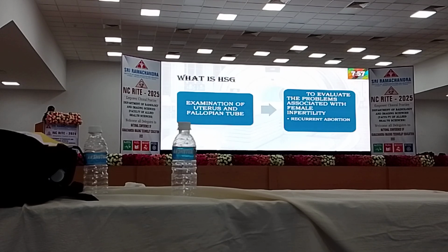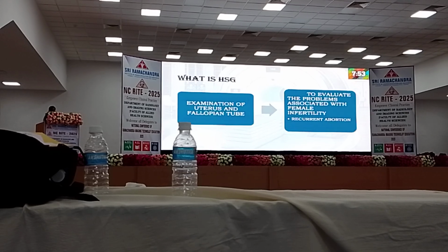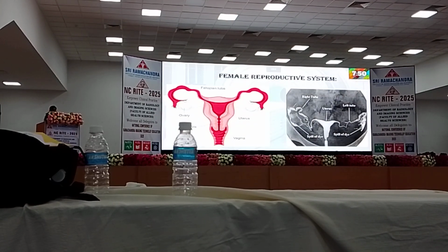First of all, what is HSG? It is an examination of the uterus and the fallopian tube to evaluate the problems associated with female infertility and recurrent abortions. This is the female reproductive tract anatomy, where the process is going to be done.